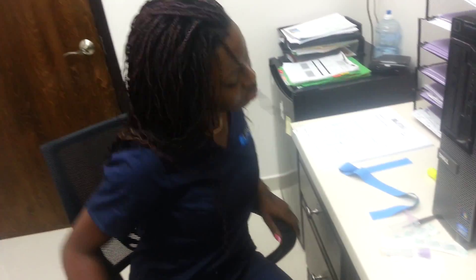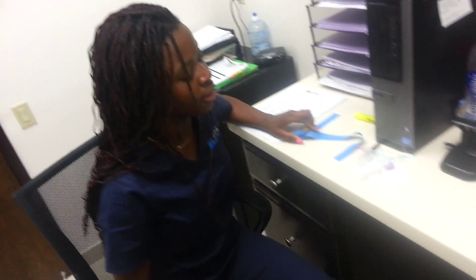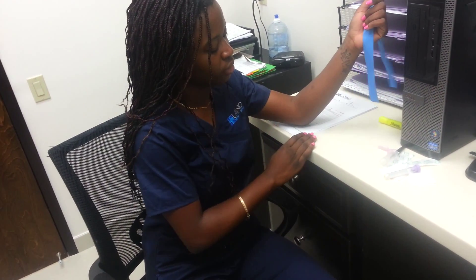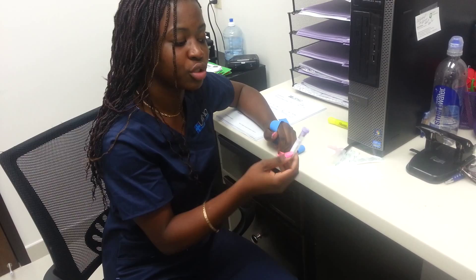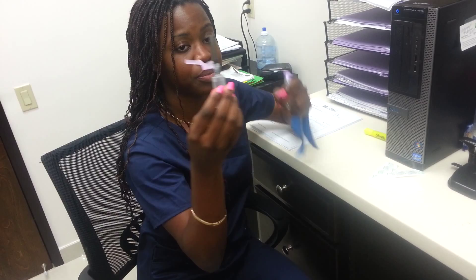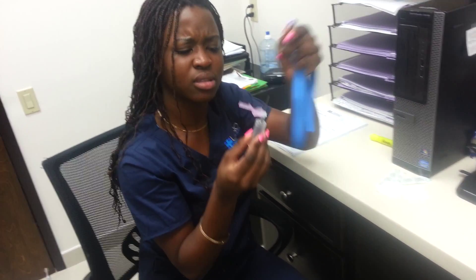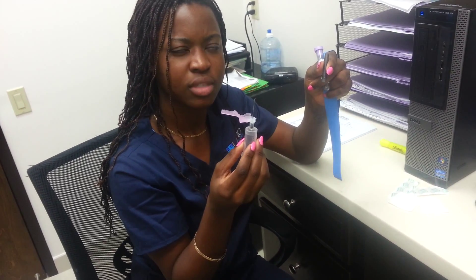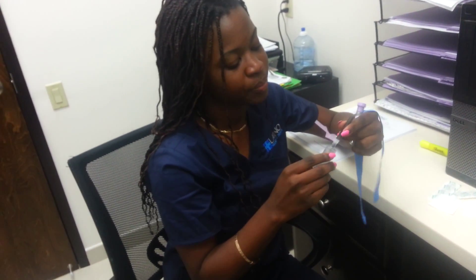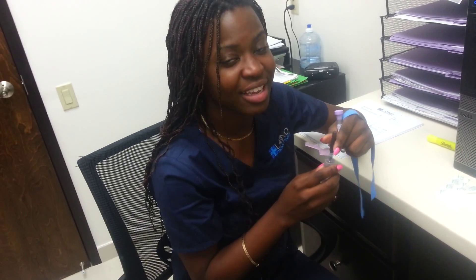What I've volunteered to do is attempt — I won't be successful, but I call it an attempt — because this is the first time I'm actually using a tourniquet, but I've done this before without the tourniquet. I'm going to attempt to withdraw my blood into this tube with this needle. I believe this is a 22 gauge. Not the biggest, but it's huge. And no, I'm not crazy. I'm just experienced.